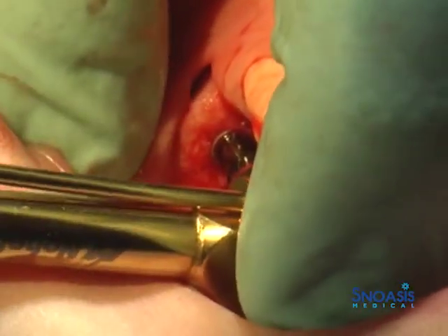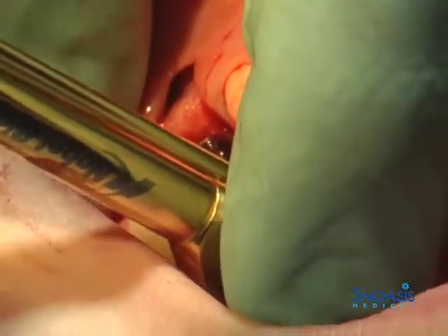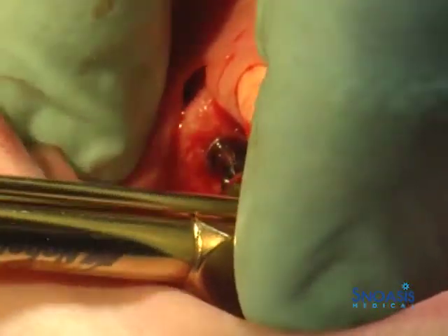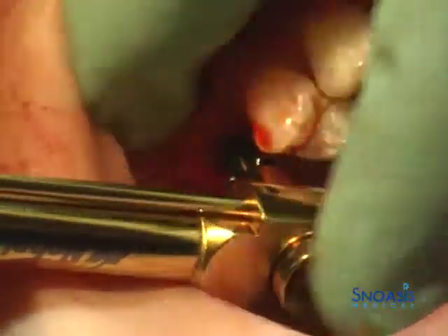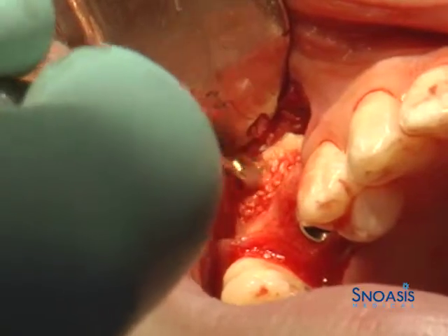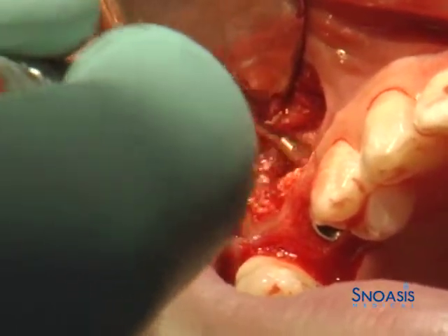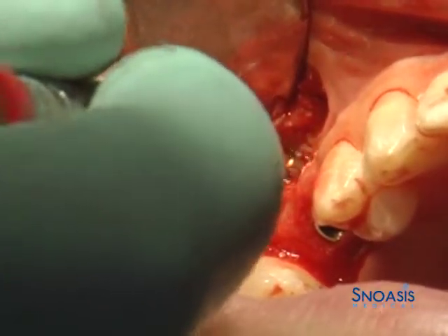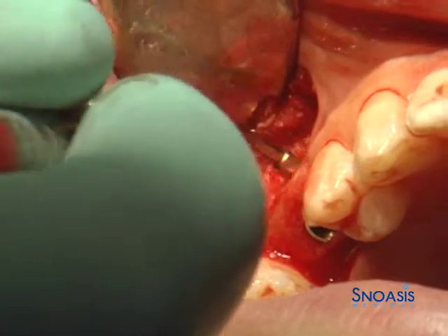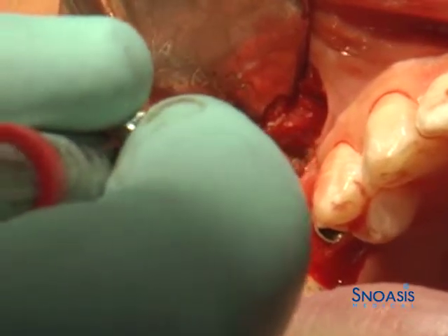A hand torque wrench is used per the NOBEL active protocol for placement of a simultaneous implant in site number 4. Final bone allograft and xenograft is placed into the sinus cavity and compressed around the implant, adequately elevating the Schneiderian membrane as well.